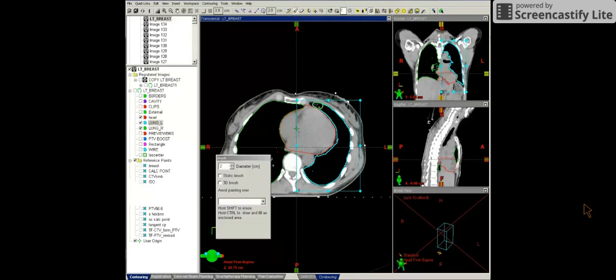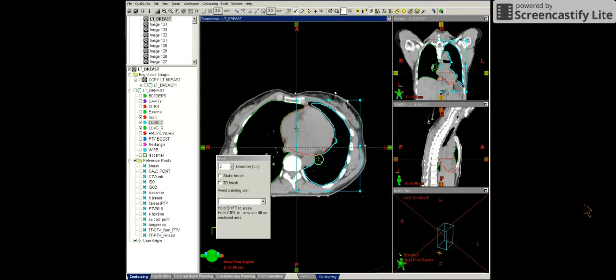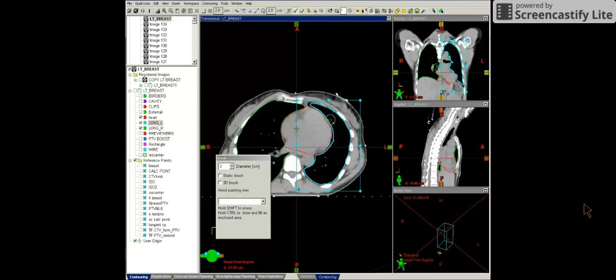So I can grab the paintbrush. Once again, as long as the static brush isn't selected, the paintbrush knows density and will stay within the lung. So I can do this on each slice. So you do have to do some hand editing with the lung contour.